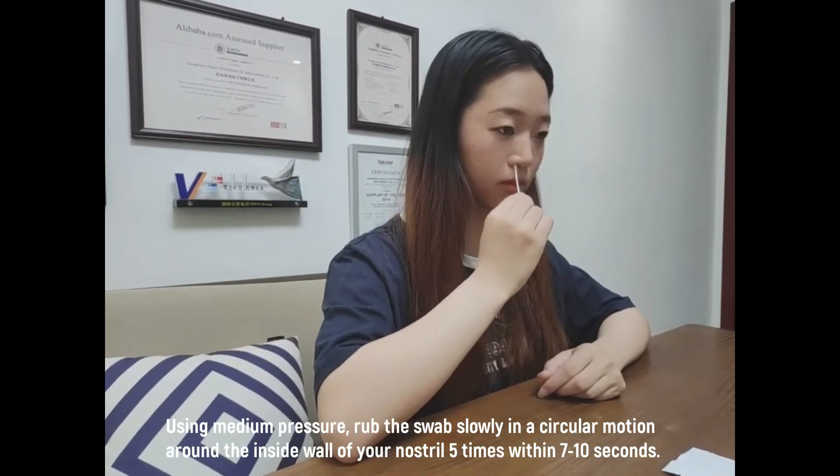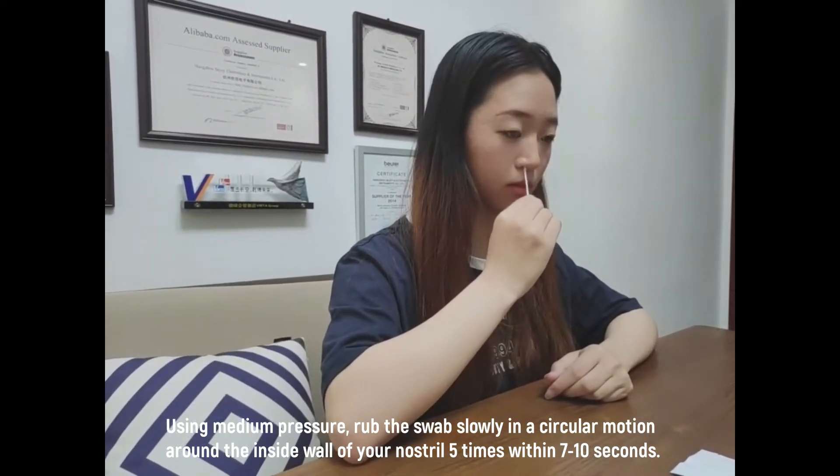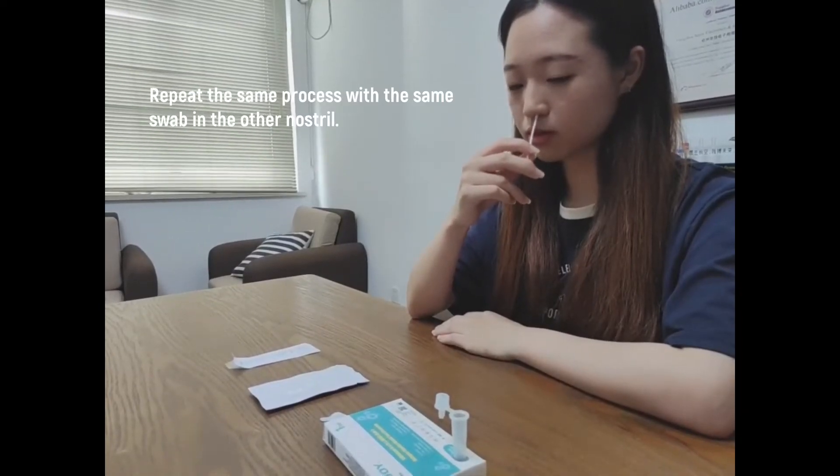Use medium pressure. Rub the swab slowly in a circular motion around the inside wall of your nostril, 5 times within 7–10 seconds. Repeat the same process with the same swab in the other nostril.